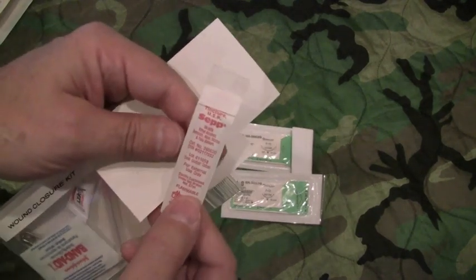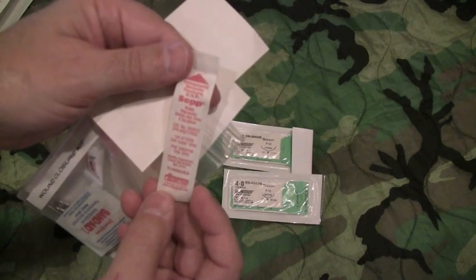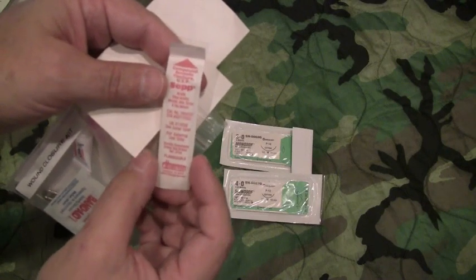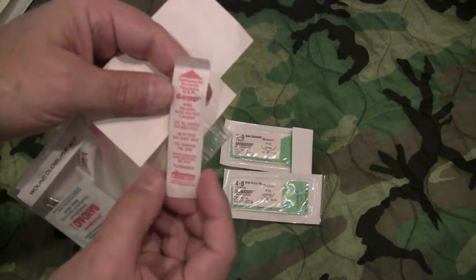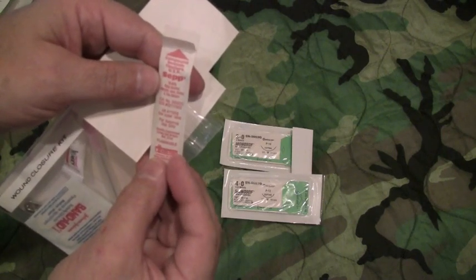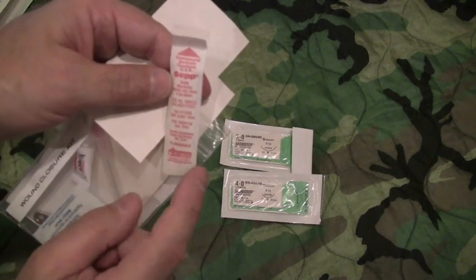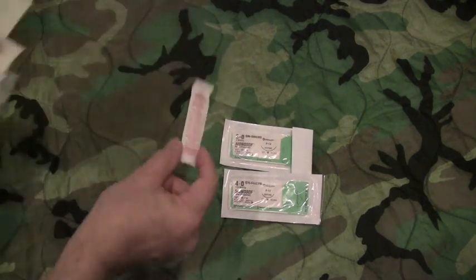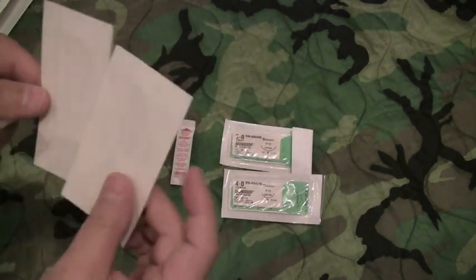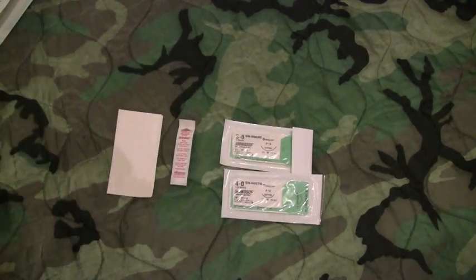If you can find these, and I found this at a major medical supply house, but I think you can also get them at REI, where they have all their refills for their first aid kits. This is an ampule of tincture of benzoin, and again, that's going to help with making tape and butterfly dressing stick to skin. These are the 2 packs of steri strips, 1/4 inch and 1/2 inch.